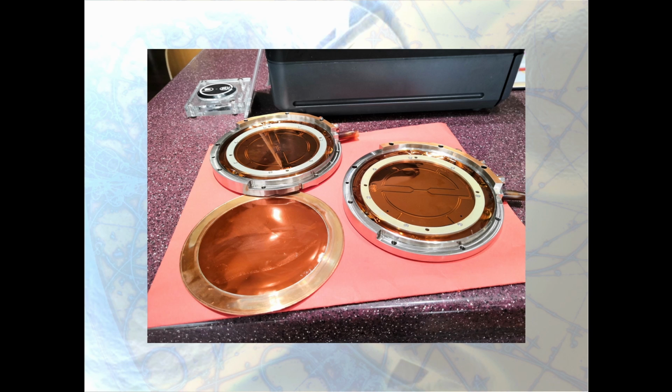You can see here such a double ionization chamber. There you've got, let's say, the upper electrode, the lower electrodes. I said electrodes because there are 2 of them here, 2 of them here, and you've got a mid plane because you have to apply voltage between the reference plane and electrodes.